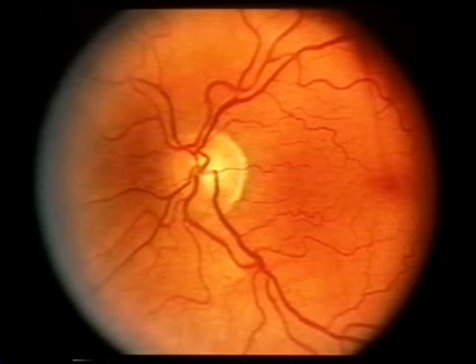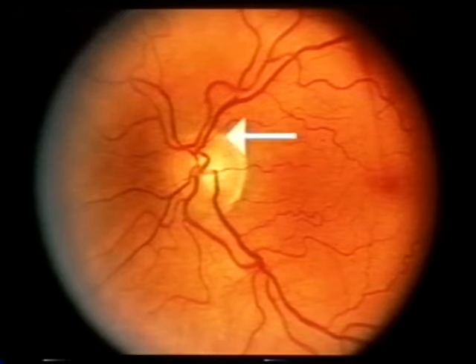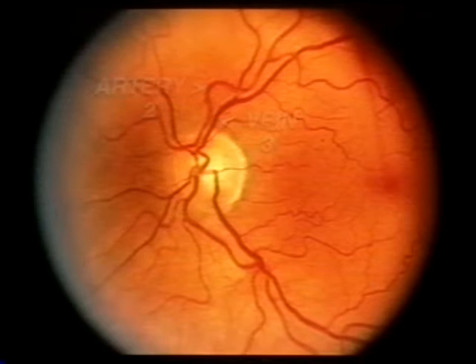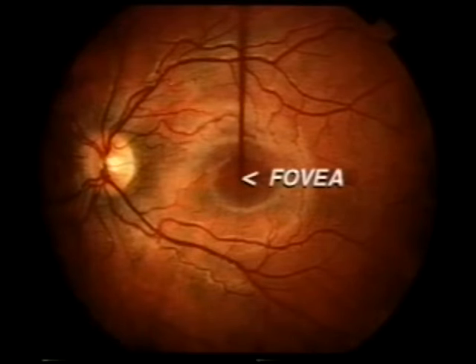Next, study the arteries and veins which emerge from the nerve. Follow them in all four directions: superior temporally, inferior temporally, superior nasally, and inferior nasally. The vein should be thicker than the arteries, in approximately a 3:2 ratio. Next, have the patient look at your light. You will then be looking at the patient's fovea, which is the center of the macula, the area of most precise visual acuity.